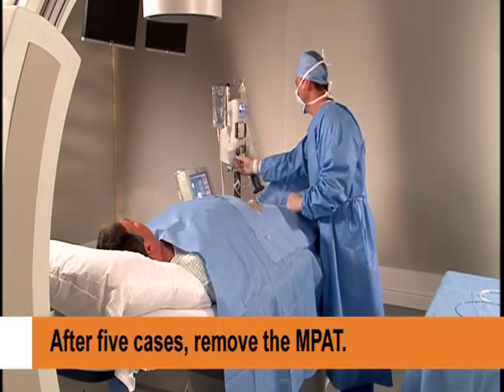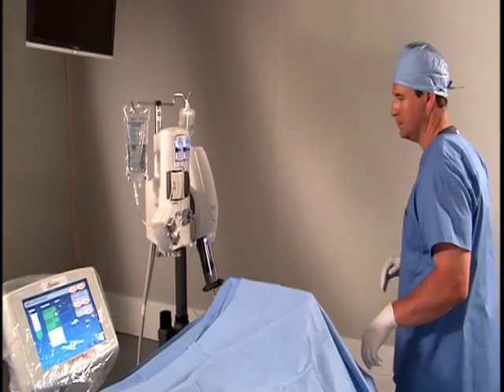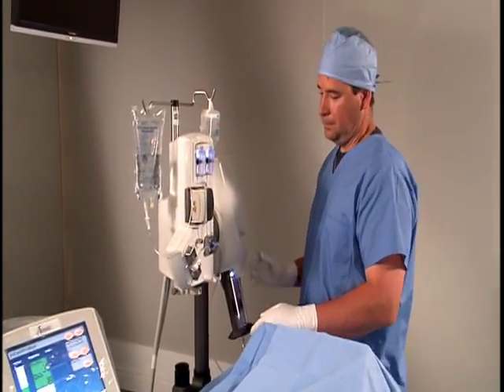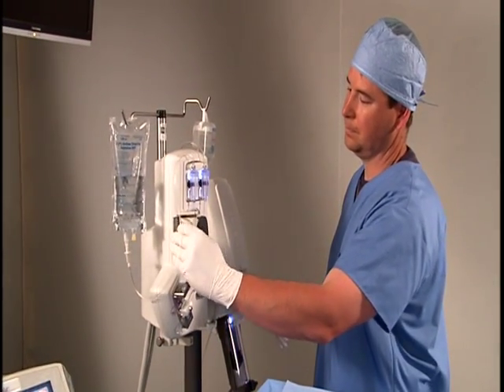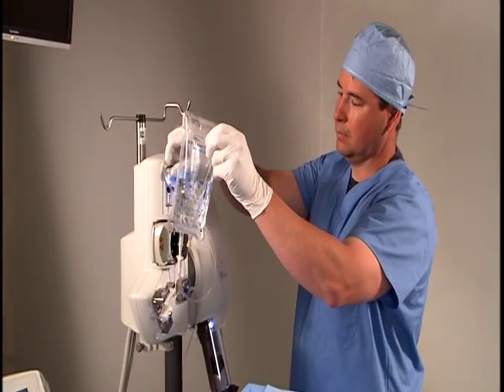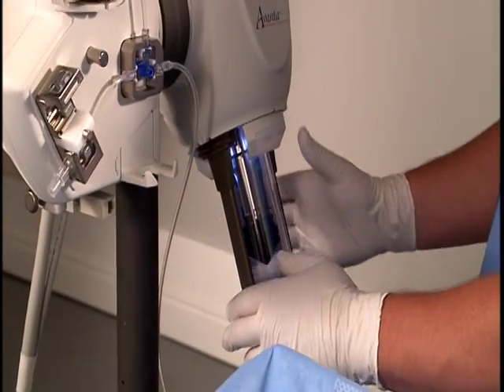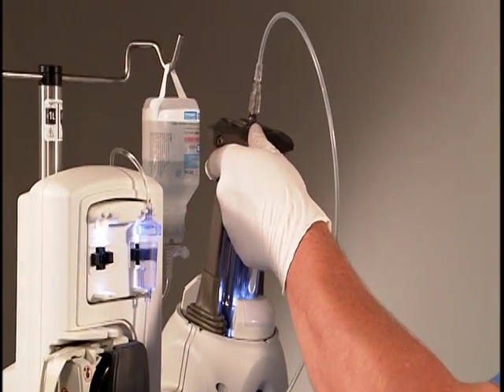After 5 cases, remove the multi-patient disposable set. To replace the multi-patient disposable set, open the gross air detector doors and the peristaltic pump door. Remove the saline tubing and bag. Next, remove the multi-patient contrast tubing set. Release the drop front arm and remove the syringe.